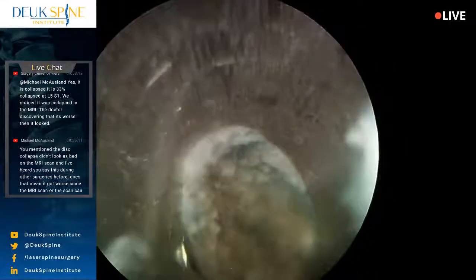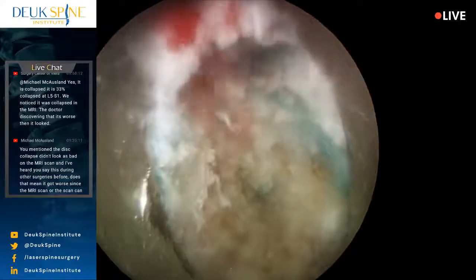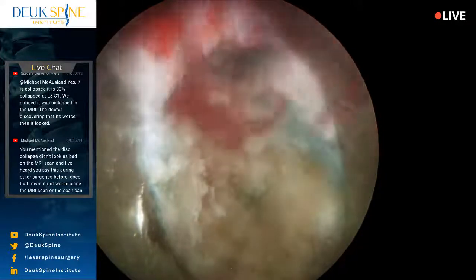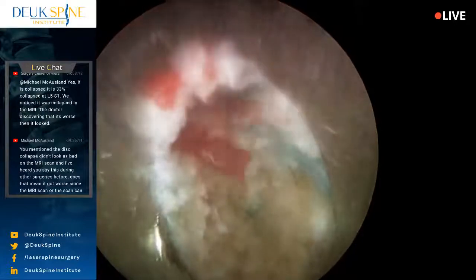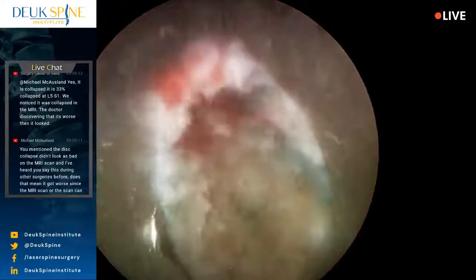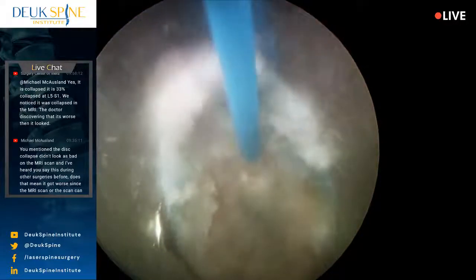Endoscopic spine surgeons that do transforaminal disc surgery, like through the foramen like I'm doing, they don't do L5-S1. They leave it alone. And 50% of the disc problems are at L5-S1. So some of them will actually do what's called an interlaminar or translaminar approach, where they actually go through the lamina.